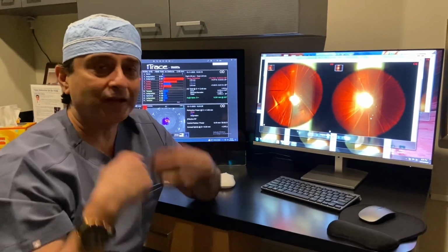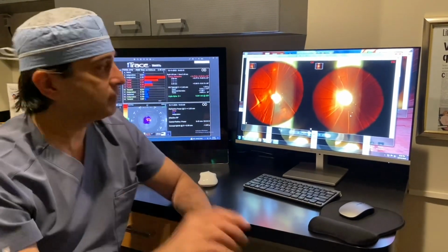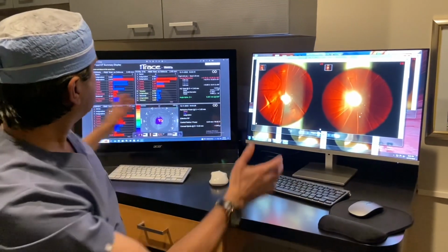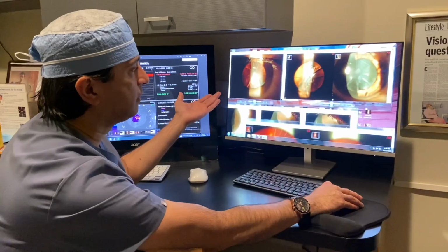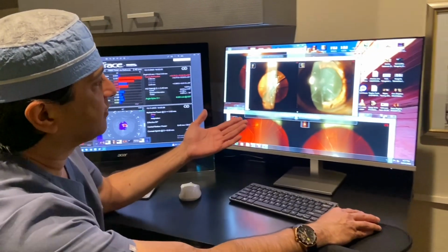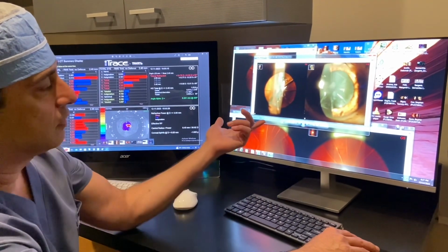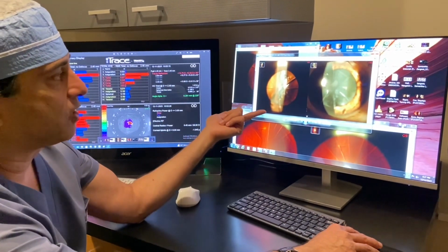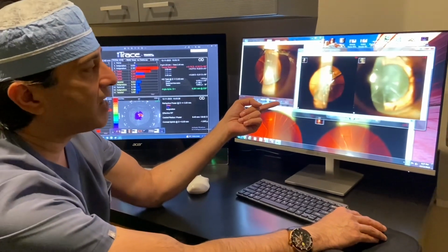So it's not just what lens. Lens is a small ingredient and important, but one ingredient in the recipe that I have to go through tonight. That's what I'm spending hours on. This is what the basis of lensoplasty is. Look at this patient from New Mexico. Look at this eye. Look at the cuts. Look at the level of elevation, ectasia of the cornea. 13.2, we just saw the topography. I have to perform surgery through this cornea and understand what optics to bring.